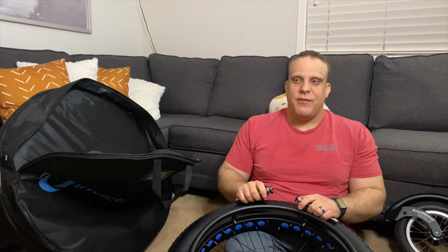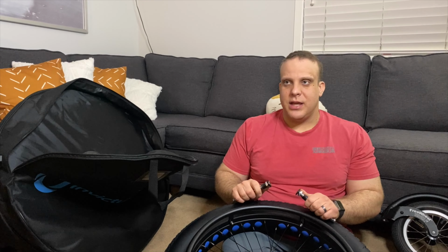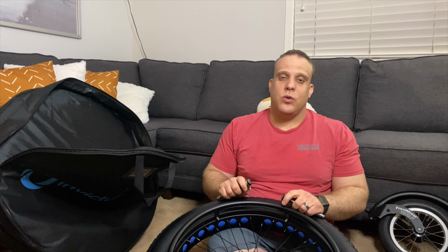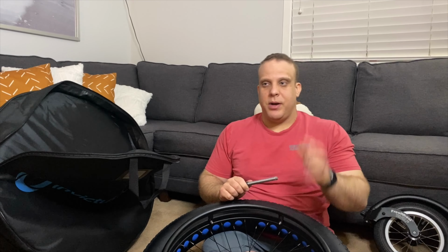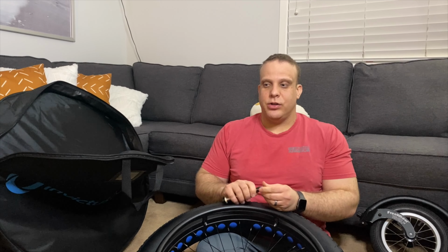Sometimes I've had a lot of bad luck with not gate checking, what's the opposite of gate checking? Ticket counter checking wheelchair equipment, because I feel like the longer the airline has your equipment in their possession, unfortunately, the more opportunity they have to break it, whether inadvertently or by being careless. So I would always recommend, if you have equipment like this or a spare chair, that you insist on gate checking it as much as possible. There have been very few times where I've ticket counter checked equipment, and usually it's because it's an old piece of equipment that if they broke, I wasn't too hurt about it.